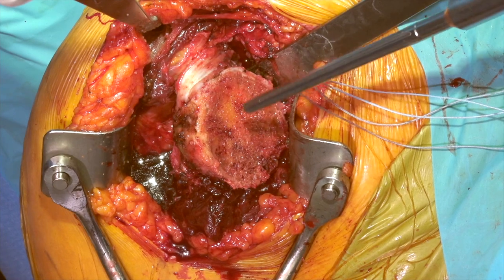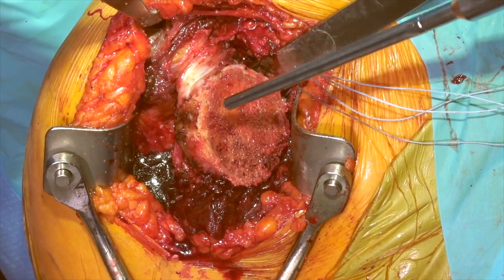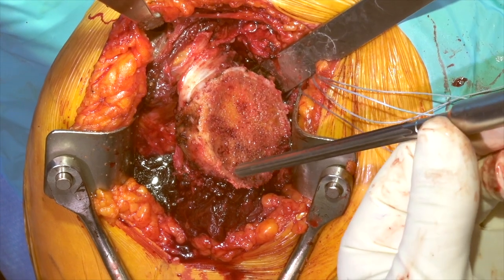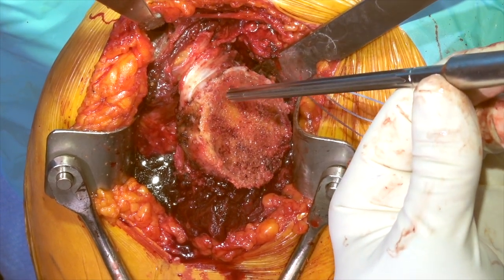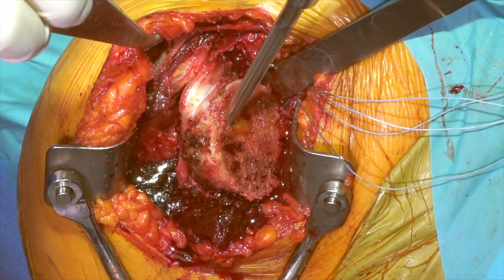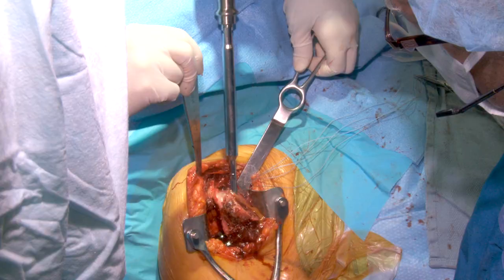We're now going to identify the center of the humeral canal. The bicipital groove is at the top here. You can also look at this cut surface, go to the most superior aspect of it, place our reamer right in position, and let it find its way down the canal.